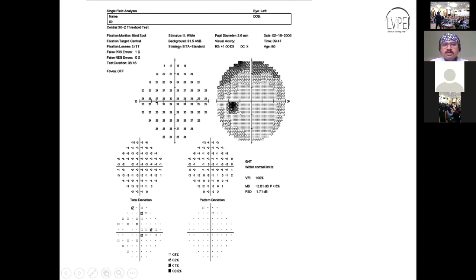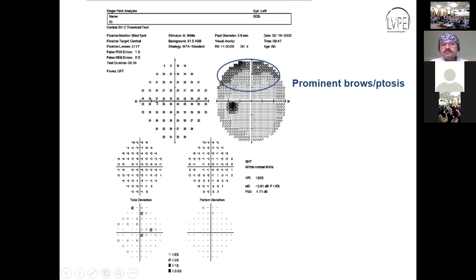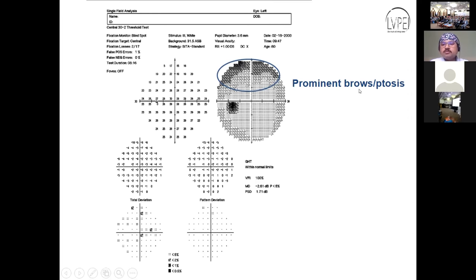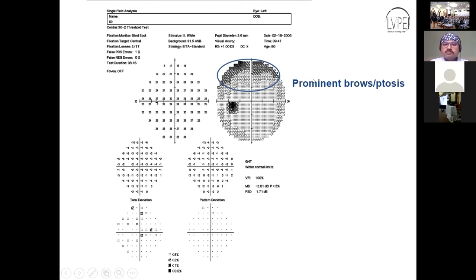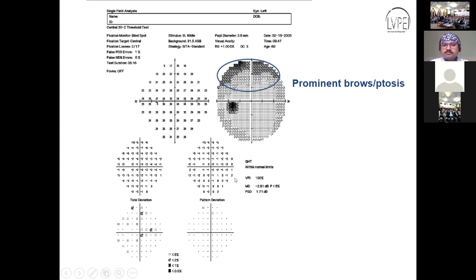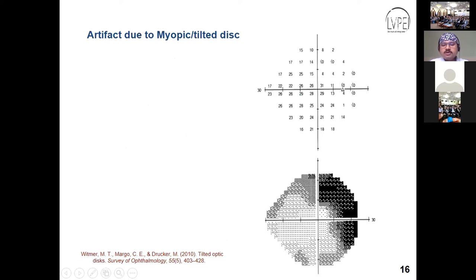Here we see a gray zone, which is prominently seen with prominent brows or ptosis. In such cases we should tape the brow or tape the eyelid to get a better result.